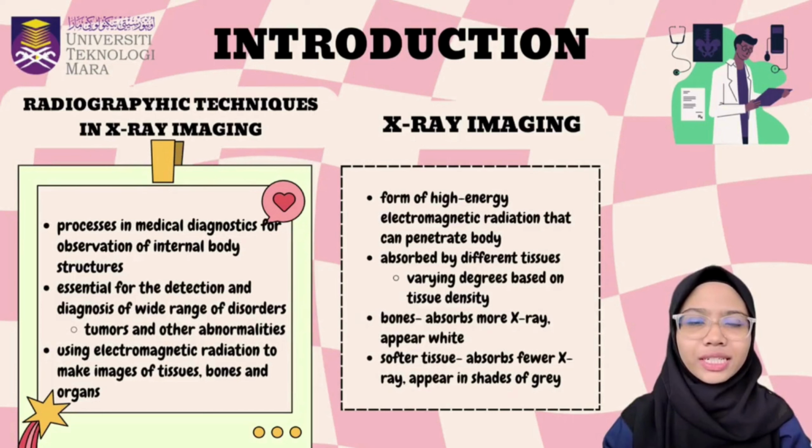For introduction, the fundamental processes in medical diagnostics that allow for the observation of internal body structures are called radiographic techniques in X-ray imaging. From tumors and other abnormalities to infections and fractures, this imaging modality is essential for the detection and diagnosis of a wide range of disorders.